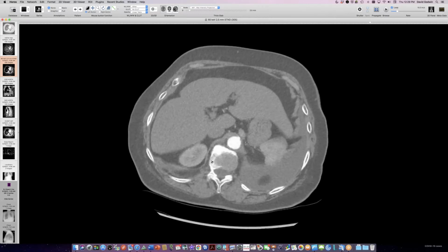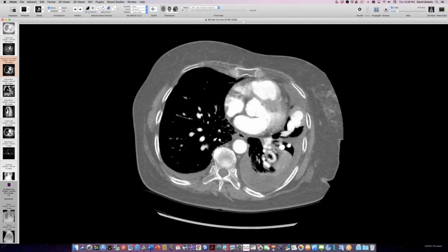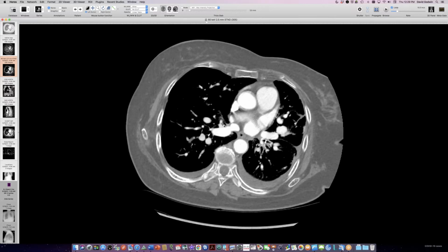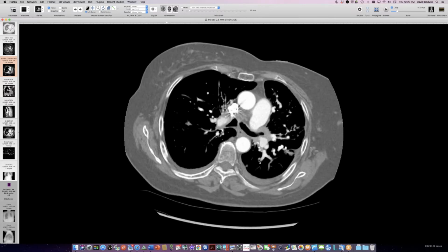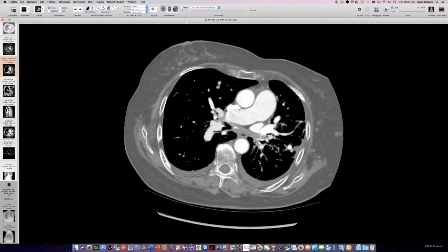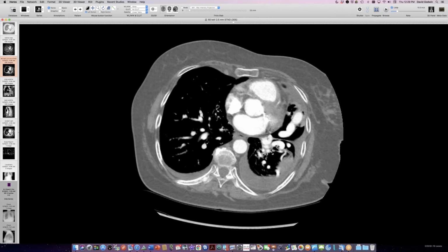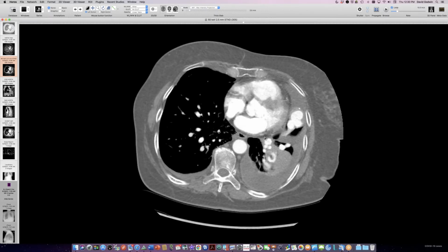What are those crazy vessels in her left lower lobe there? It's huge. Yes, I think because of her, she's got this venous obstruction going on. I didn't talk about the pulmonary veins, but her inferior pulmonary vein, I think, is obstructed. So I think she's got varices. Yeah. Here. And I think it's the pulmonary venous hypertension that is causing this pleural effusion.